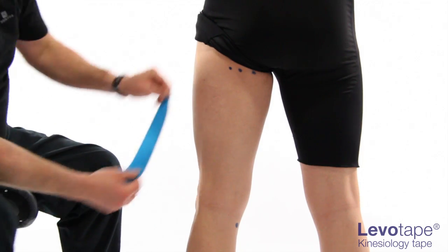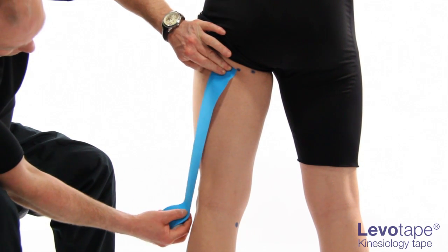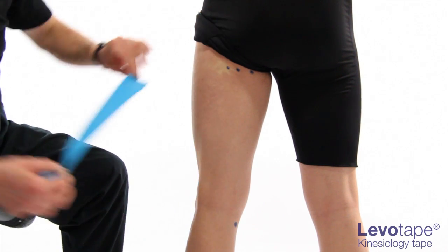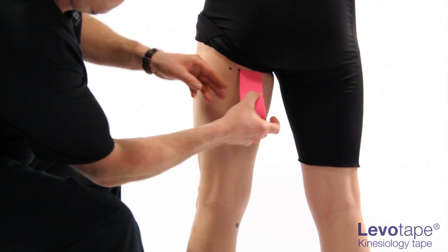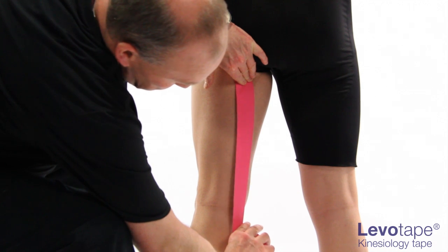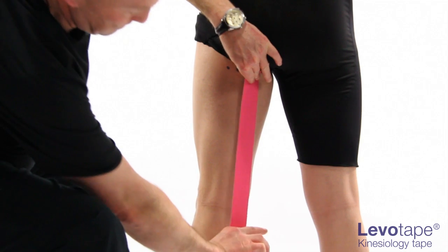With the patient standing in neutral, measure from the lateral base point to the head of the fibula. Cut and prepare an I strip. Measure from the medial base point to the tibial end point. Cut and prepare a Y strip.